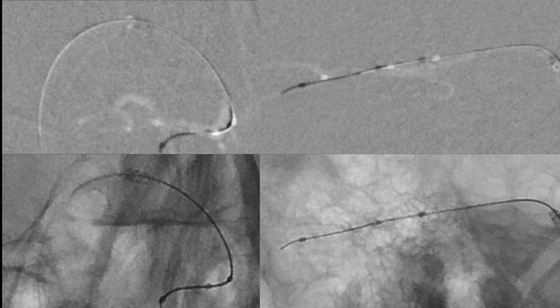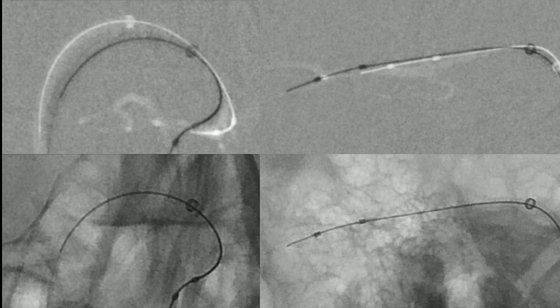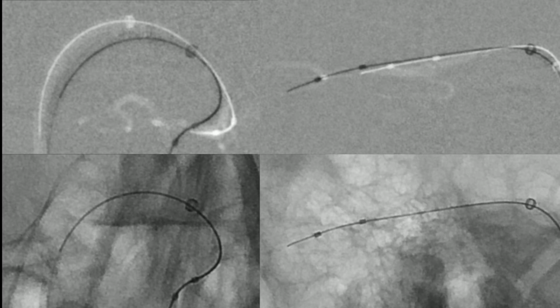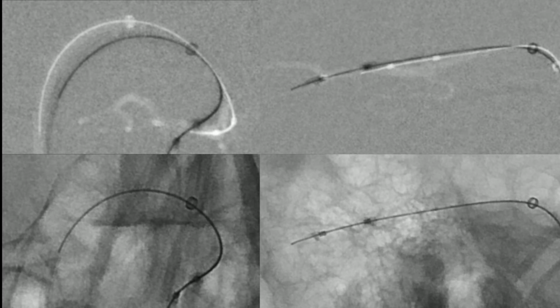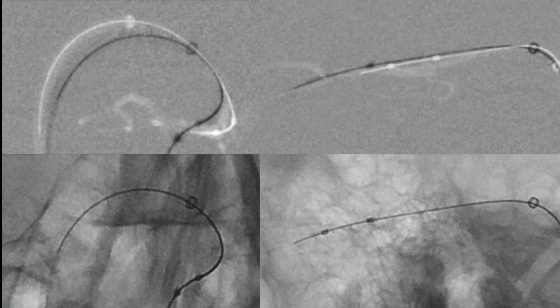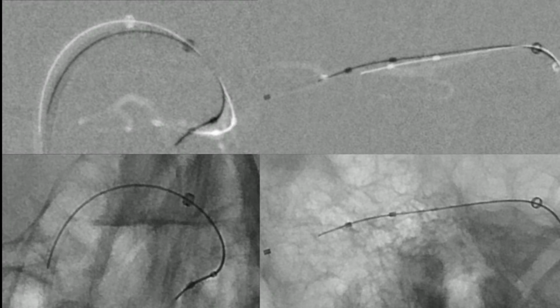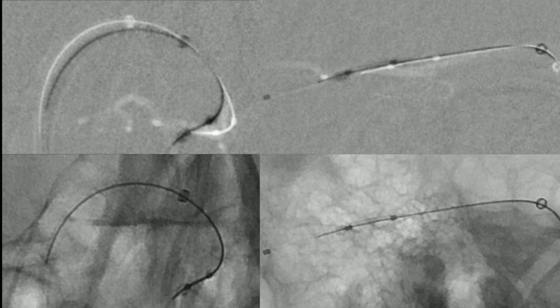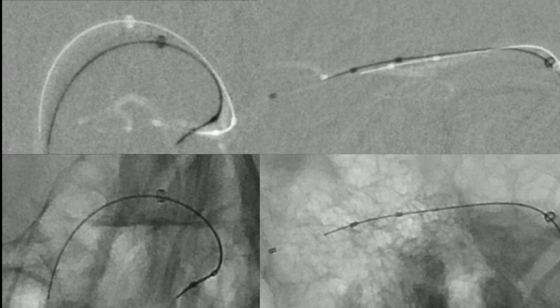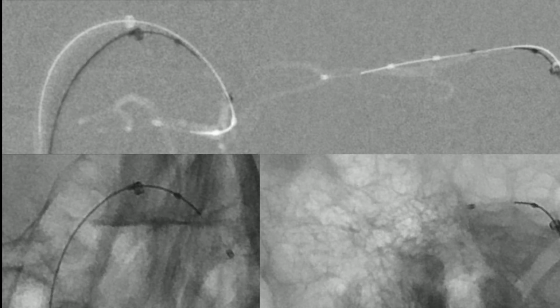And now we push the balloon catheter distally, and we need to perform the PTA immediately before the bifurcation. And this time we go only to 4 bar, not more than this. We don't want to exaggerate here in this small segment. The second one overlapped with the first one with 4 bar maximally. And now we pull back the balloon catheter and perform a 2D angiogram again to see the results.